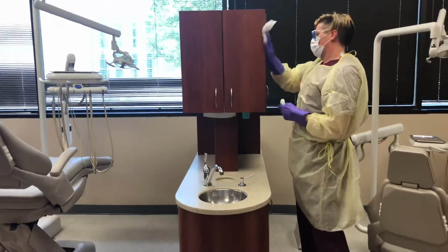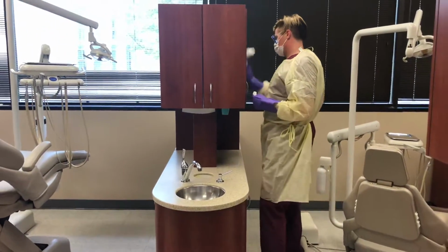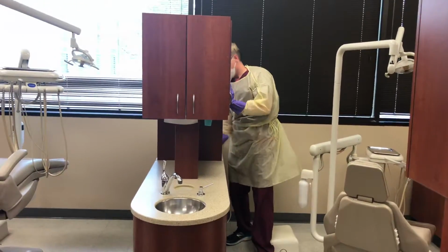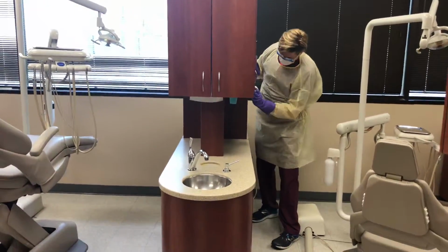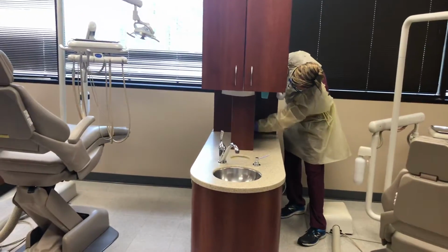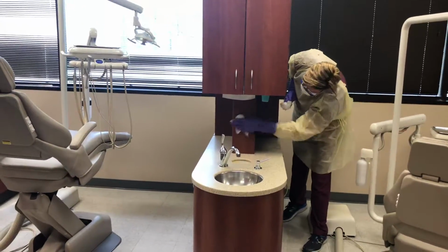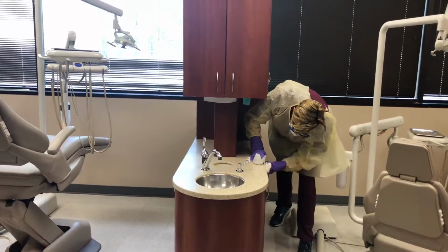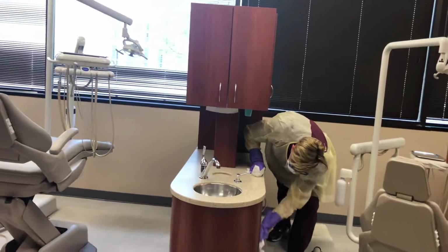Several units will share a sink in between, like you see in this video. You will do both. Students will do that entire face, sink, faucet. That way we know when it has been done. It will just be double done.